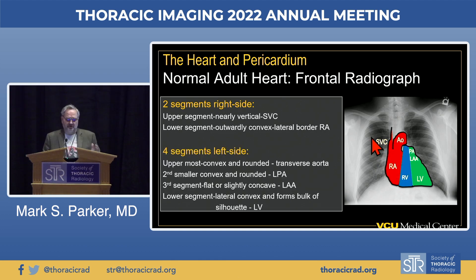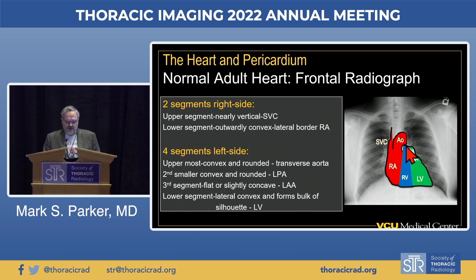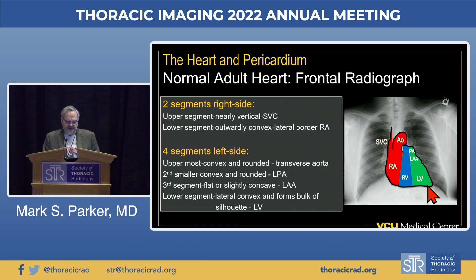Along the left side of the cardiomediastinal silhouette, we have four segments or moguls. The largest is the aortic knob or transverse aorta. Just below that, a smaller focal convexity is created by the main pulmonary or left pulmonary segment. The third smaller segment is usually flat or somewhat concave, created by the left atrial appendage. The lower segment is laterally convex and forms the lateral margin, most of which is created by the left ventricular chamber.